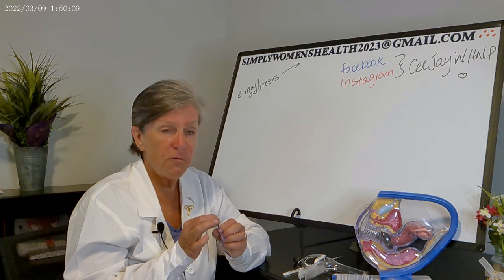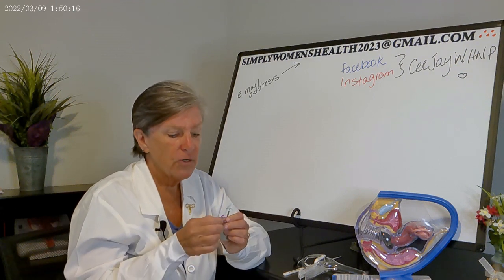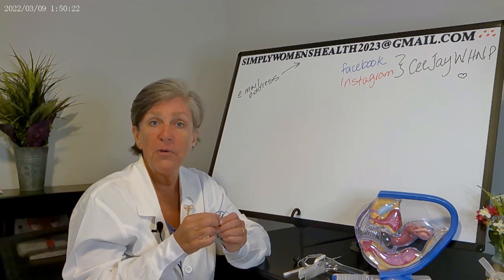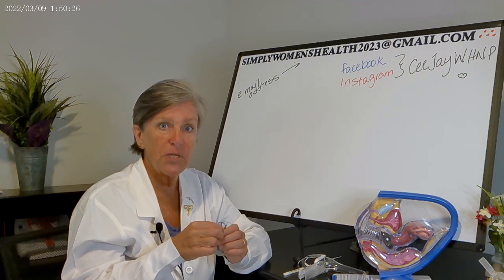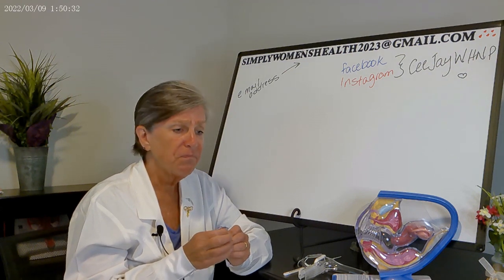Mirena is good for 8 years. It's recently gotten the FDA approval for 8 years. It used to be 5, but now it's 8. And then there's Mirena's little sister, Kyleena. Kyleena is good for 5 years. Kyleena was developed specifically for women who have never had a baby. Kyleena actually replaced Skyla, which used to be on the market. Skyla was good for 3 years, but now we have this device, which is actually good for 5 years.